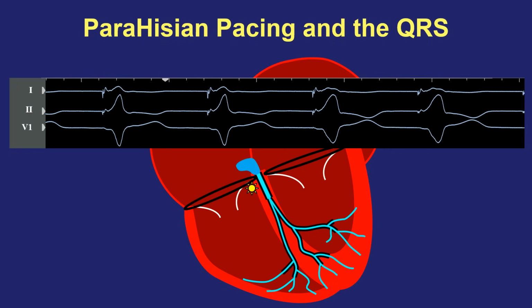And what we were doing during this maneuver is we were reducing the output. We started with high output, capturing a larger radius, and then as we turned down the output, we shrunk the radius of capture and we ceased to capture the His tissue directly and only ventricular muscle, and therefore we generate basically a PVC-like QRS without contribution of the His-Purkinje tree.